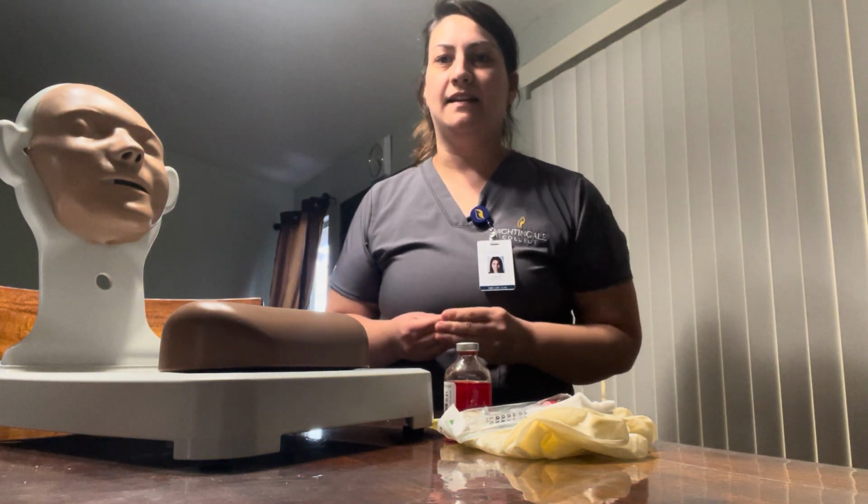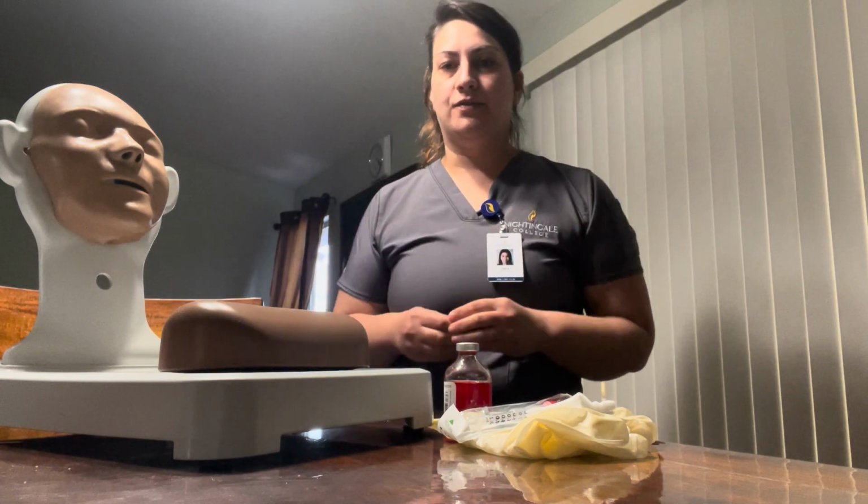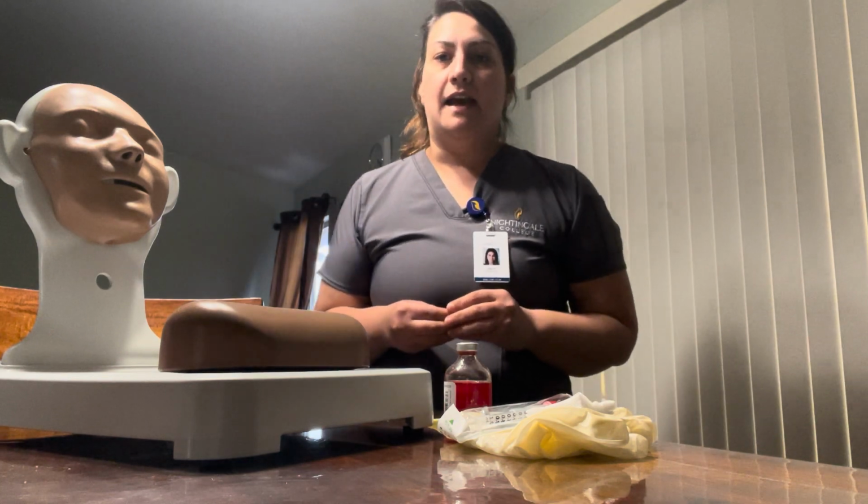Today I'm going to be presenting the subcutaneous injection. I'm in my appropriate school uniform. I will start by going over some of the supplies that I'm going to be using.